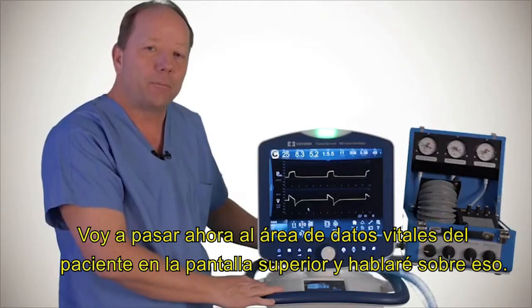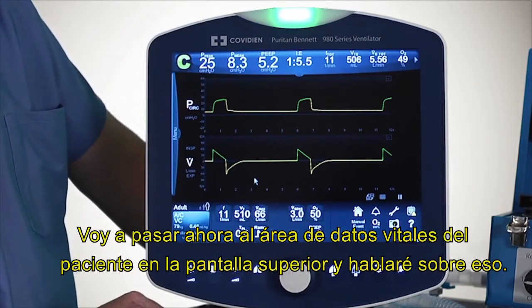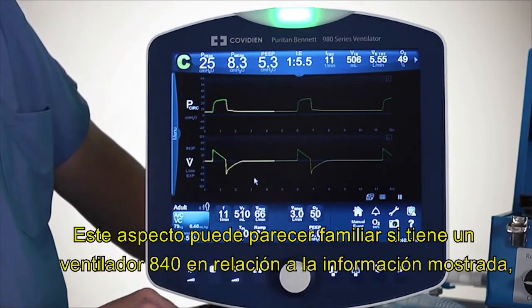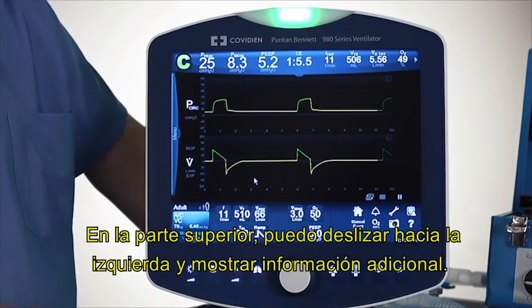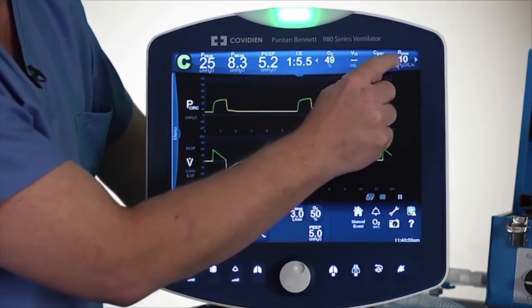I'm going to now move up to the patient vital data area on the top screen and talk a little bit more about that. Right now this may look very familiar if you have an 840 ventilator in terms of some of the information. But now we have some enhanced customization that you can do. So at the top, I can swipe to the left and reveal additional information.